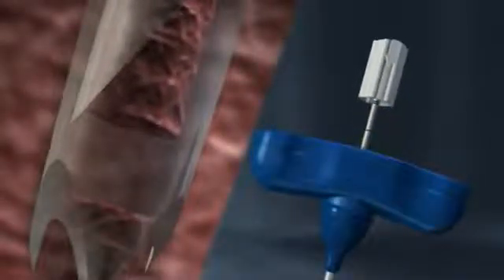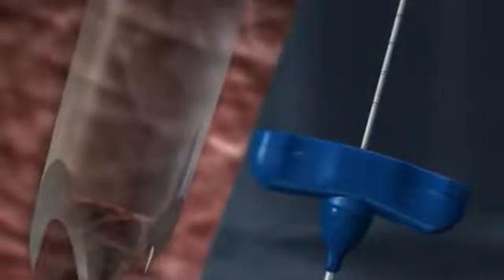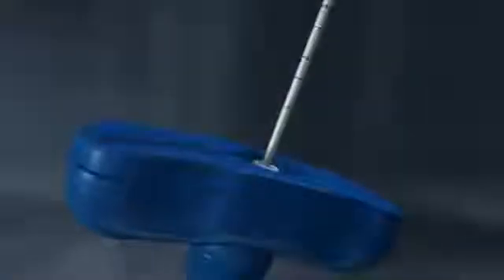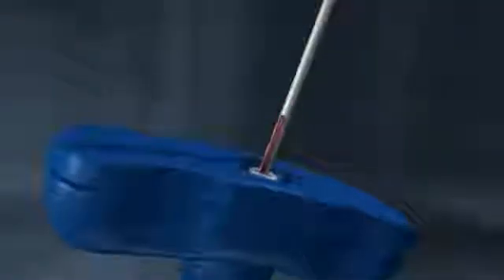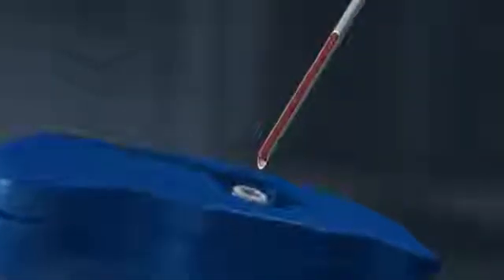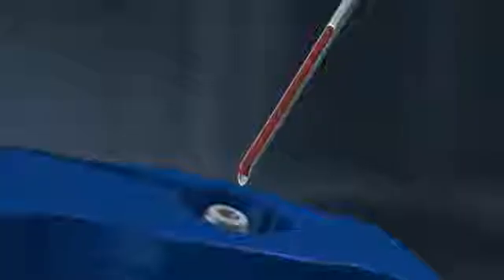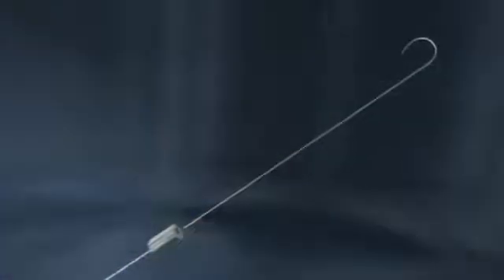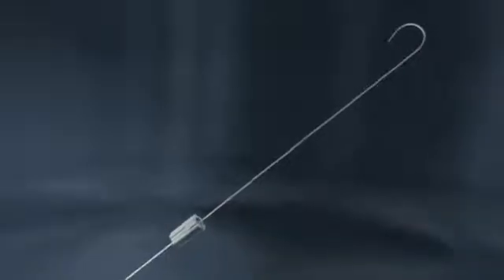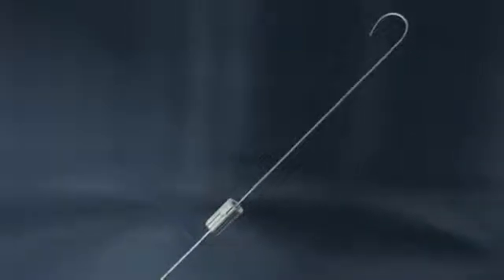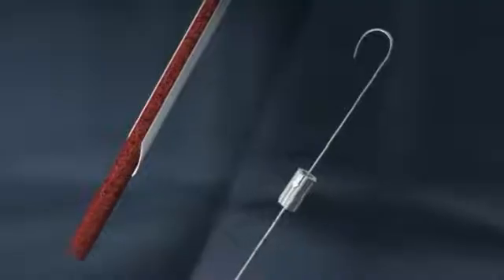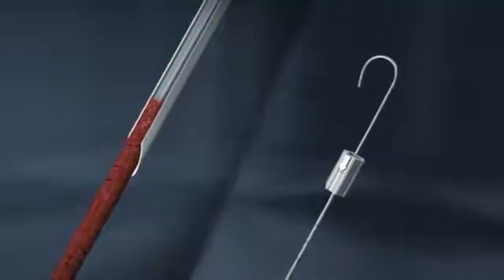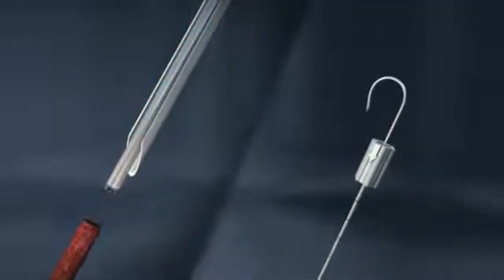The marrow acquisition cradle is then withdrawn from the cannula. The specimen's trephine rests in the trough of the marrow acquisition cradle, which securely holds the sample, reducing the chance of it getting dislodged accidentally. The sample is ejected from the cradle by advancing the support rod through the proximal end of the cradle. Ejecting the sample from the distal portion of the marrow acquisition cradle reduces the risk of dangerous needle sticks that are associated with normal specimen retrieval.